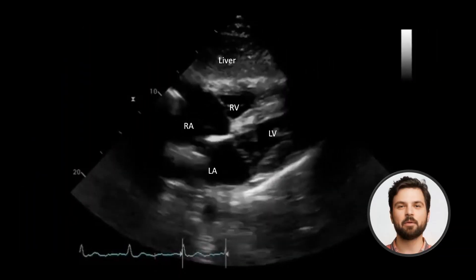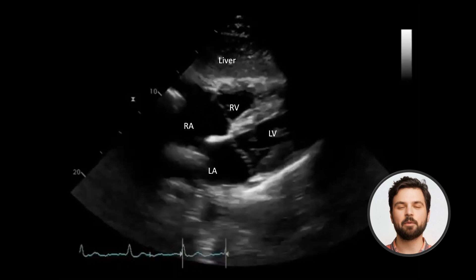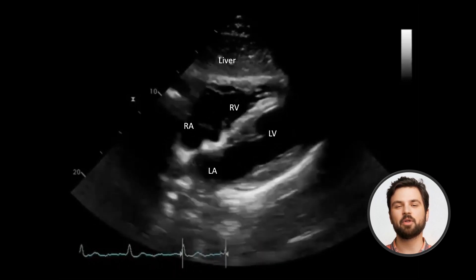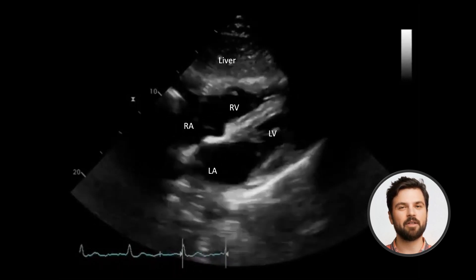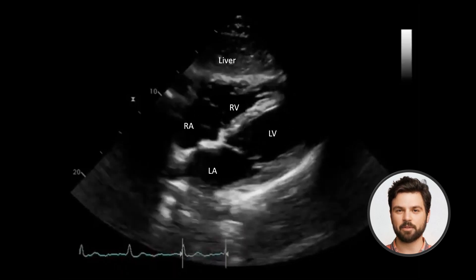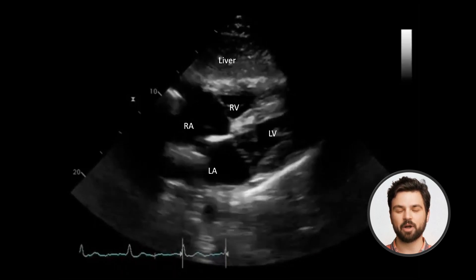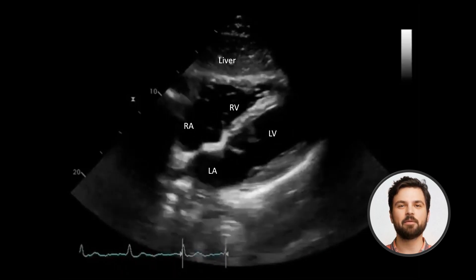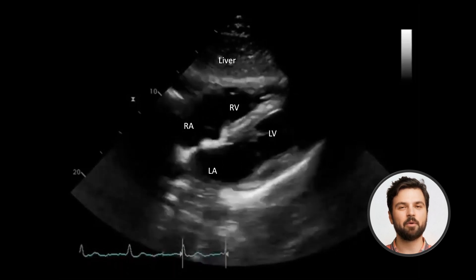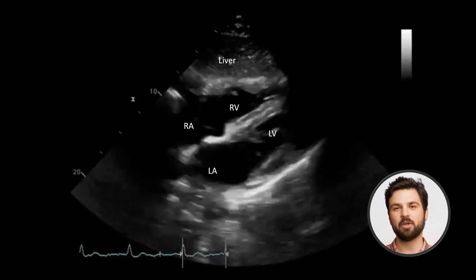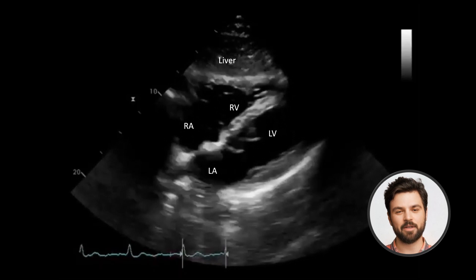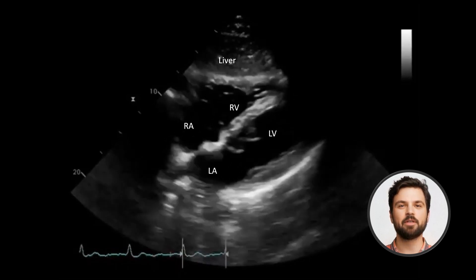In the subcostal view, the right atrium and right ventricle are seen closest to the transducer at the top of the display. The left atrium and left ventricle are in the far field. This view is useful for evaluating all four chambers, looking for interatrial or interventricular septal defects and pericardial effusions.